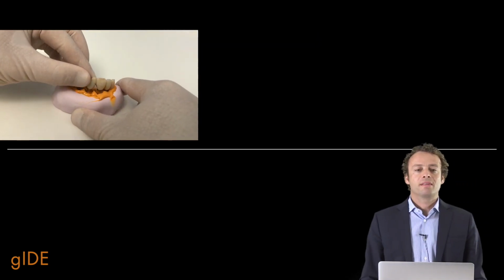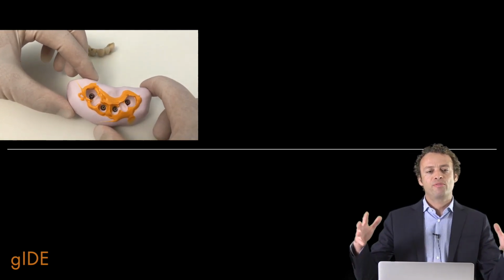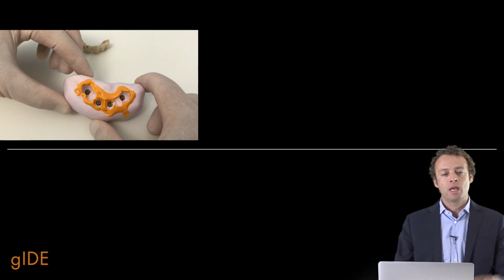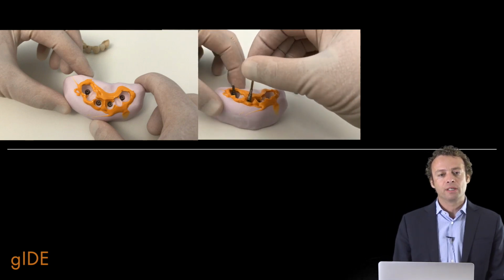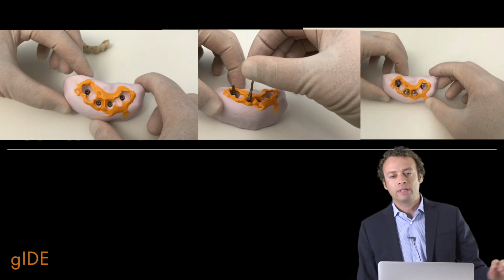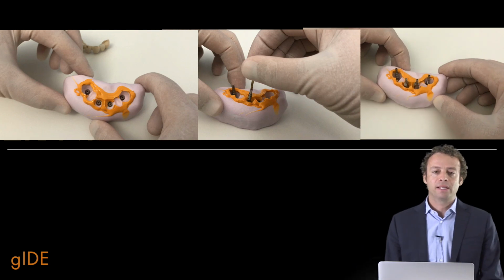Once the setting is concluded, we remove the temporary, and of course also in this situation we have the perfect negative shape of the subgingival profile of the temporary, including the pontic areas. So we connect the impression coping to the implant replica, and then we fill all the negative shape of the subgingival profile of the temporary with a new material that is Luxabite by DMG.